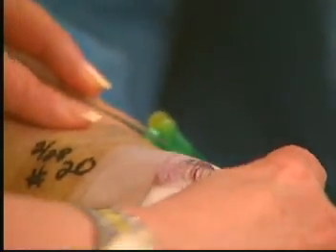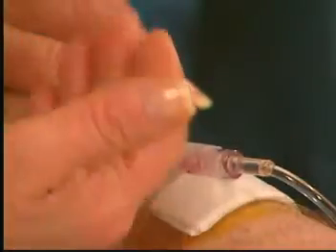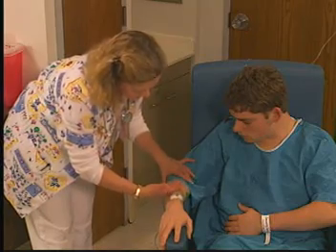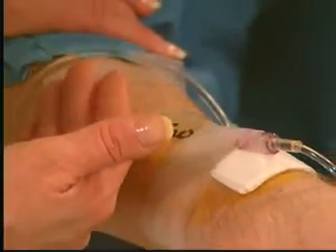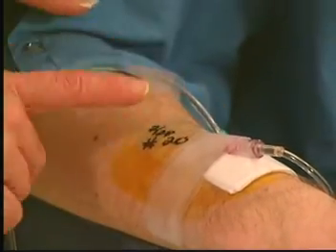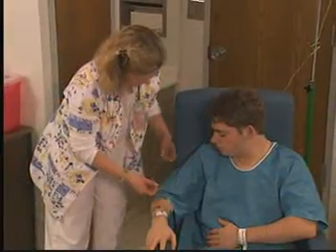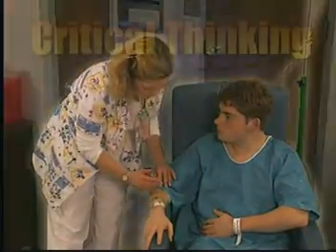The dressing should be dry and intact. Palpate the skin around the infusion site. The skin temperature should be normal with no swelling, and the patient should not be experiencing any pain. Use your critical thinking skills to evaluate your assessment findings and to take appropriate action when you suspect the development of a problem. Doesn't seem to be leaking from anywhere.